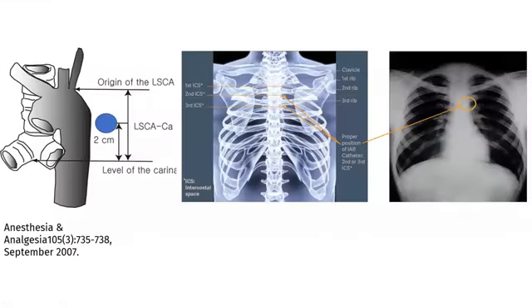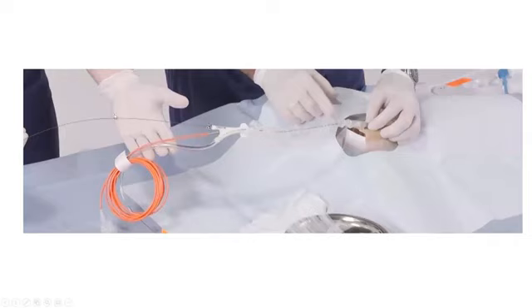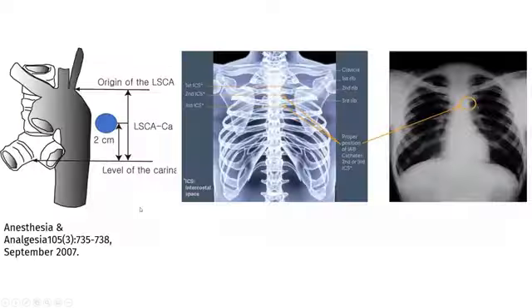Then after you get it in, you make the connection to the extension helium tubing, this here, you connect the fiber optic, and you connect the arterial line at least to a pressure bag, if not to the back of the console, as I explained previously.